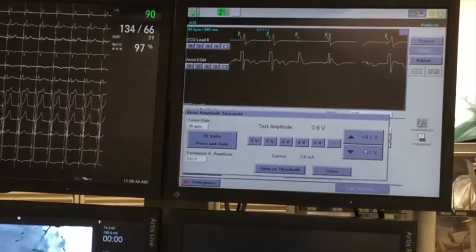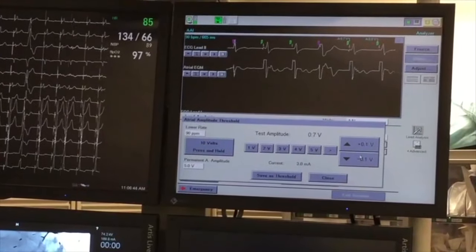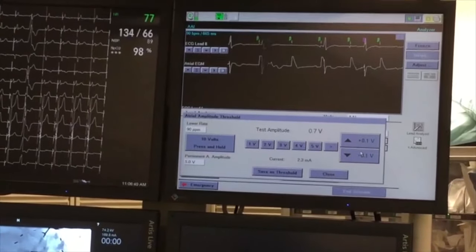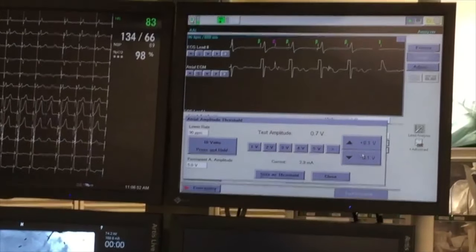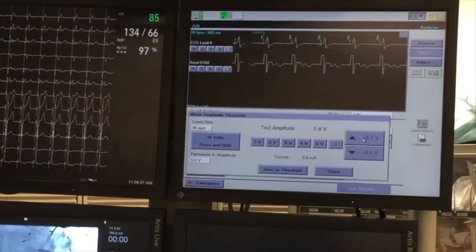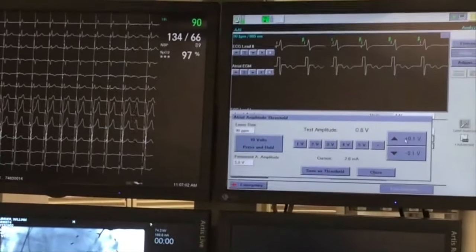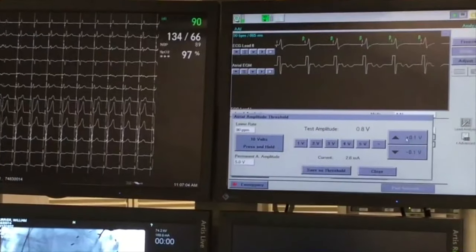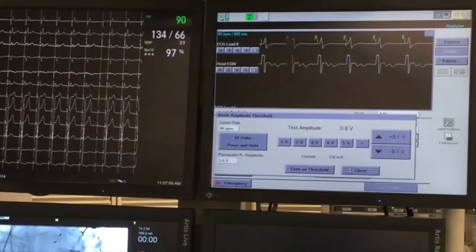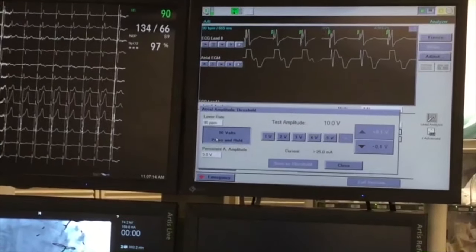Gentle forward traction is then applied to the lead tip as well as the sheath. The lead is then rotated in a clockwise direction 4 to 5 times. It is very important to gently rotate the lead and to feel the torque being transmitted to the tip of the lead. Once the lead is let go, it has a tendency to unwind. This usually confirms that the lead tip is well anchored. The sheath is then gently pulled back on fluoroscopy as the lead is advanced. A certain amount of slack is allowed for the lead tip to sit well within the right atrium.